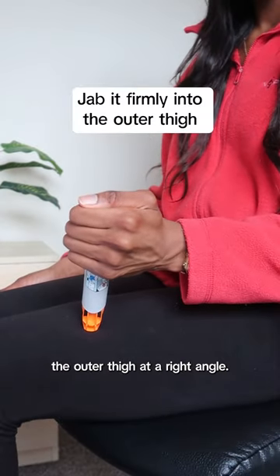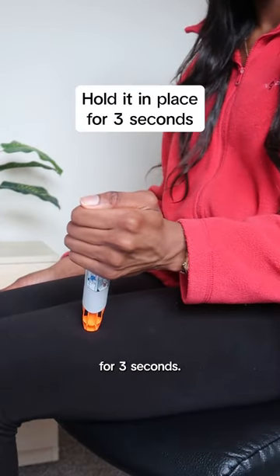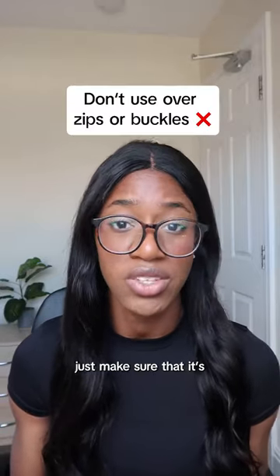Jab it firmly into the outer thigh at a right angle. Hold it there in place for three seconds. You can do it over clothing, just make sure that it's not over zips or buckles.